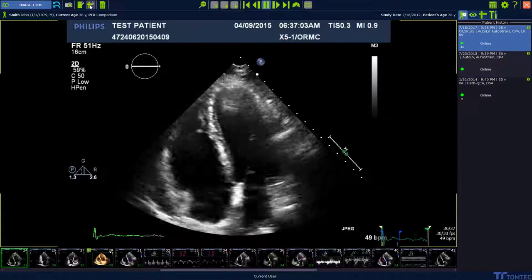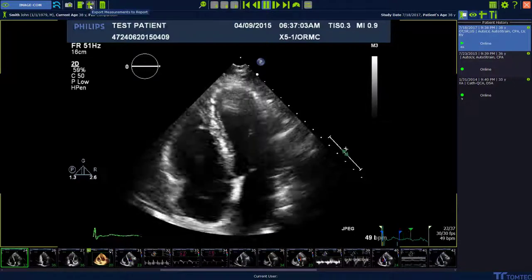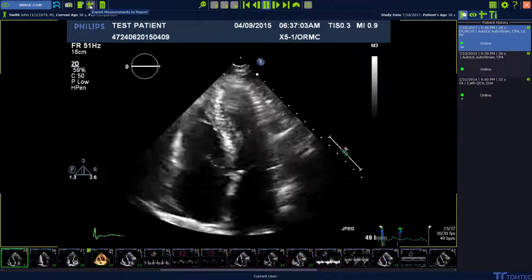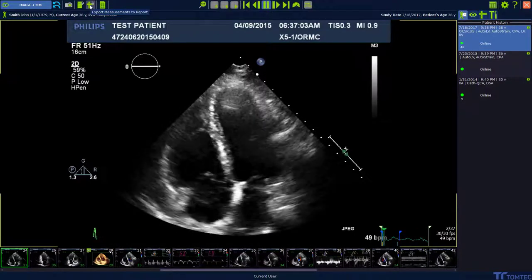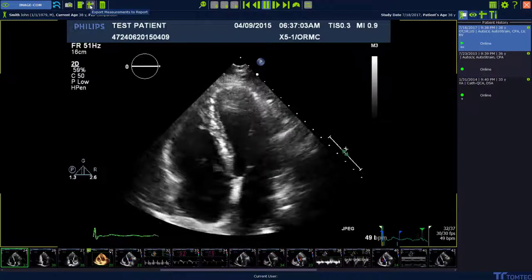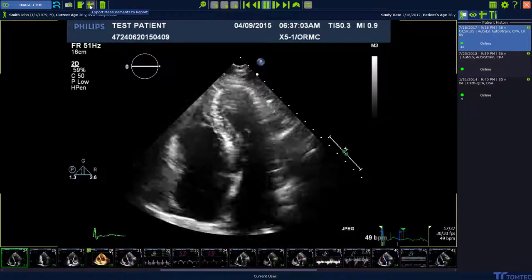Export measurements to connected systems: to export your measurements via structured report to any other connected system, press the export measurement to report button on the top of the toolbar.